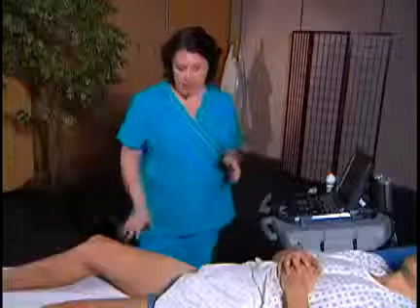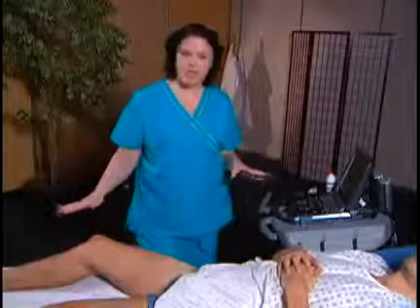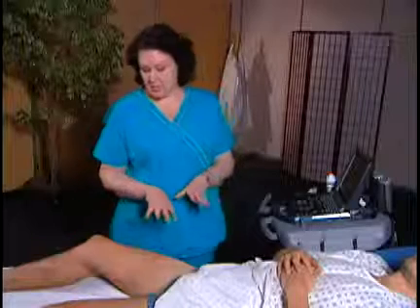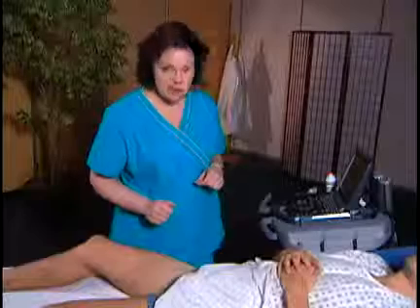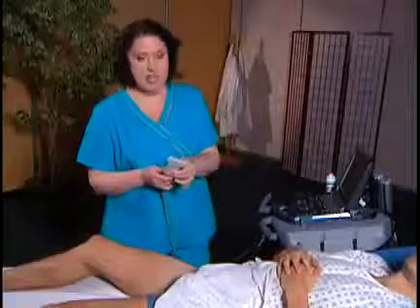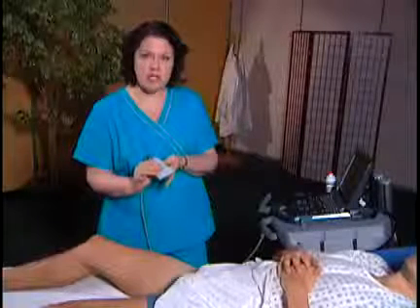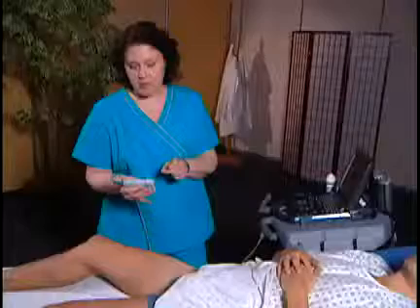To set up for this examination, you want to tilt the gurney so that you're in a reverse Trendelenburg. This encourages venous distension in the leg, so it's easier to visualize the veins with ultrasound. We're going to use a linear transducer for this examination, and the views will just be in a transverse orientation only. Make sure the orientation marker again is to the right.